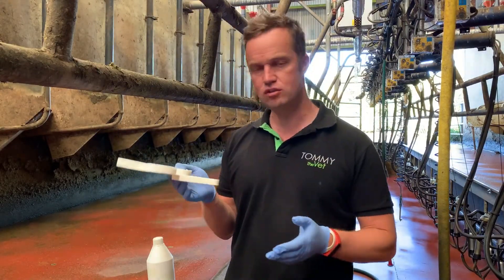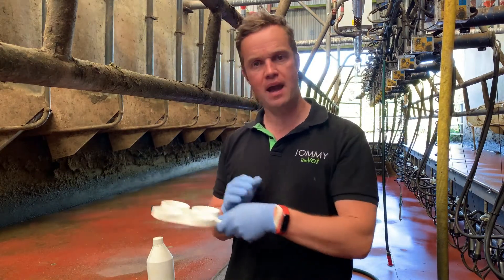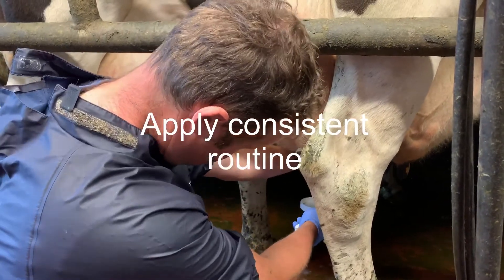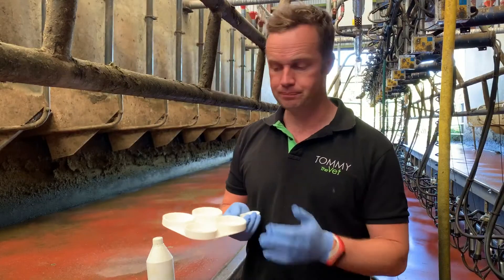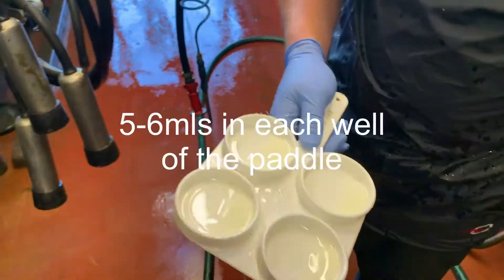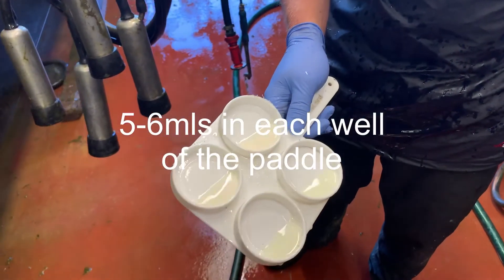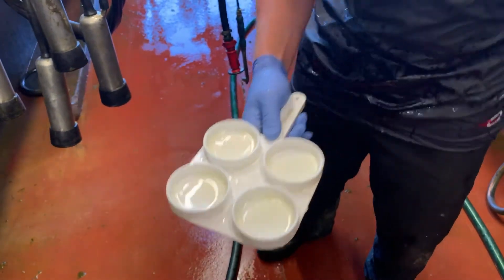This is your typical paddle. I always put the handle toward the tail so I'm going in from behind: front left, front right, back right, back left. We're trying to get an equal volume of milk in each section of the paddle. Let the first one or two squirts go on the ground, then fill the paddle with three to four squirts, and tip the paddle to make sure you have an equal volume of milk in each quarter.